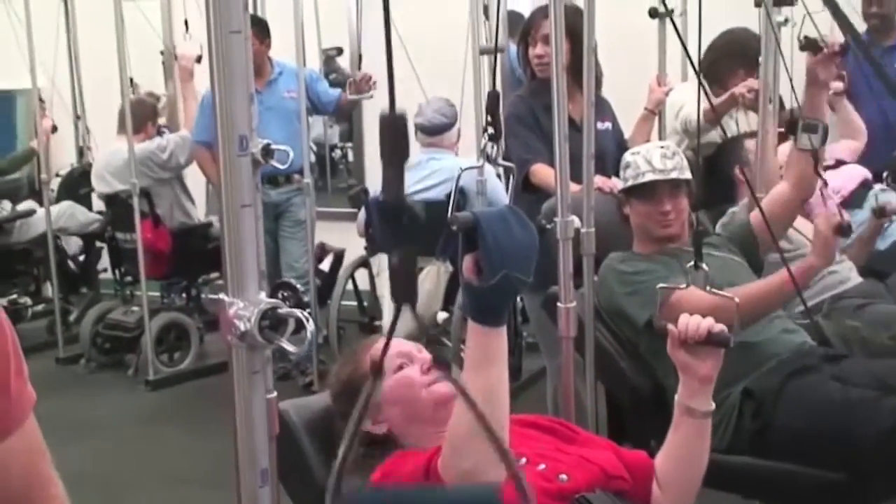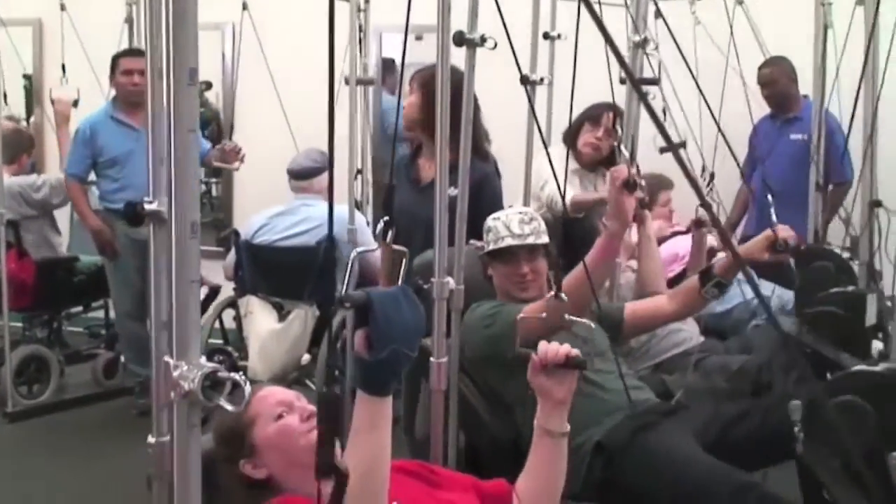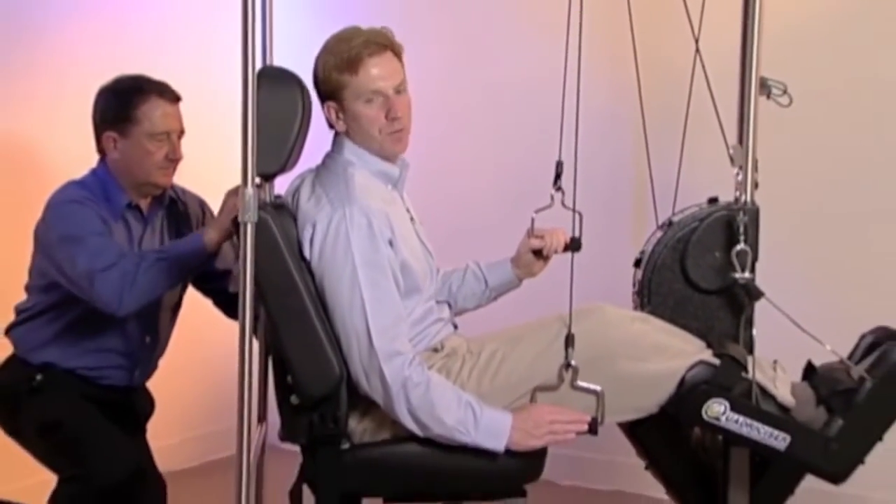The quadricizer is an excellent tool to assist the physical therapist. It's important to recognize that it is a tool — in the hands of a skilled physical therapist, it can be a perfect adjunct in the treatment plan alongside different modalities of treatment. This is a simulated walking device that mimics the natural gait pattern of human movement.